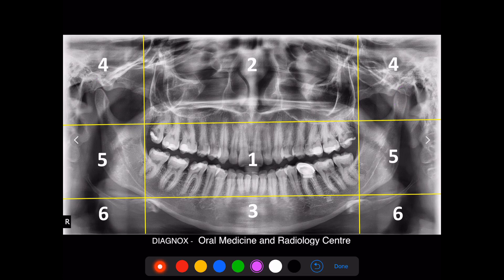Also, don't forget to check the articular eminence as well as the articular fossa bilaterally, because associated with the condylar head there will be some amount of flattening on the articular eminence or articular protuberance. In this segment, the other important finding you are going to see is the external auditory meatus — that black area which you are seeing is called the external auditory meatus. After that, you can move on to zone 5.